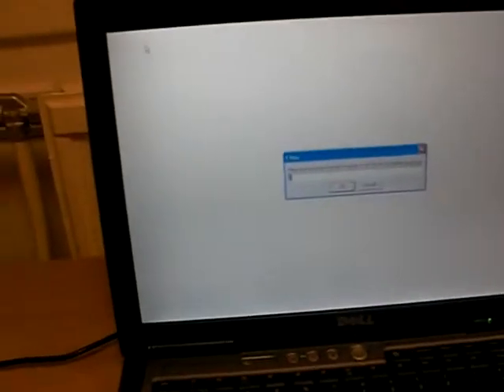To run the program, you press F7, or anyway, there's a number of different ways of running the program. Now, if this is your third participant, you'll write 103 into that box. If it's your 20th participant, you'll type 120 into that box. That number corresponds to the participant number. You have to add 100 onto it.